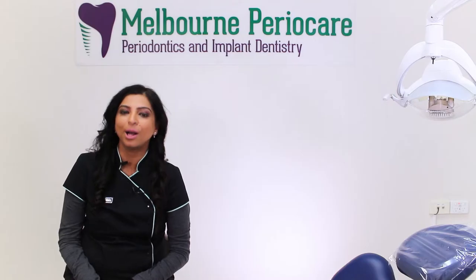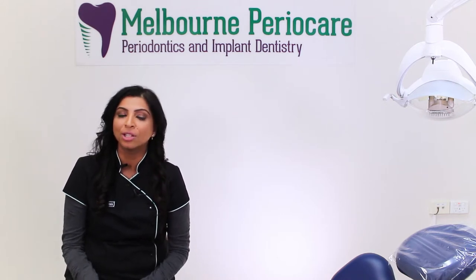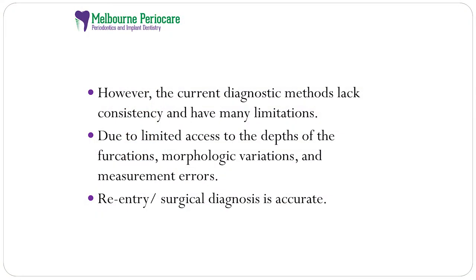Other than probing, radiographs are our usual method of detecting furcation involvement. We have intraoral periapical x-rays, we have OPGs, we have bitewings, and they're actually quite good in picking up the furcation area in the mandibular molars. However, the current diagnostic methods lack consistency and have many limitations. And this is mainly due to limited access to the depth of furcation, morphologic variations, and measurement errors. So till today, re-entry or surgical diagnosis is the most foolproof method to actually detect furcation involvement.